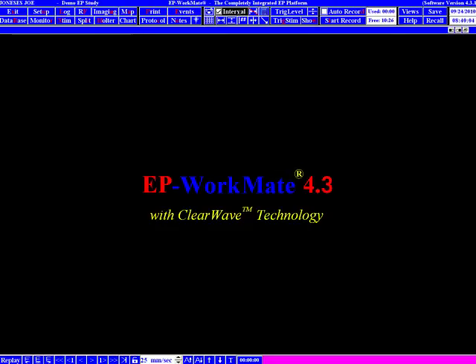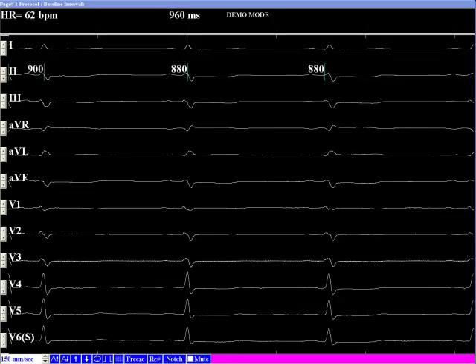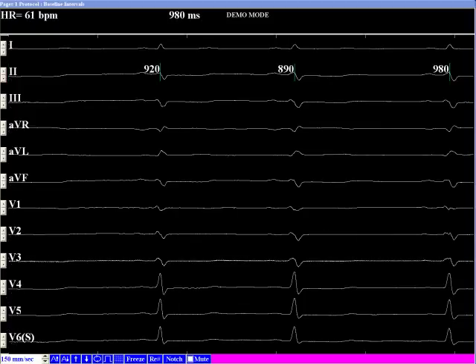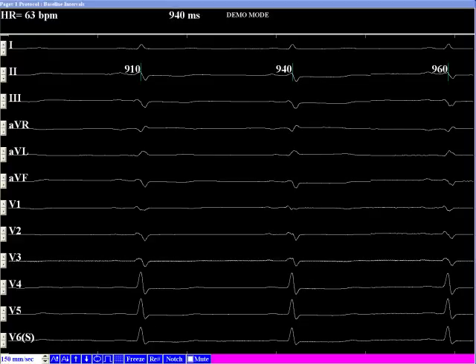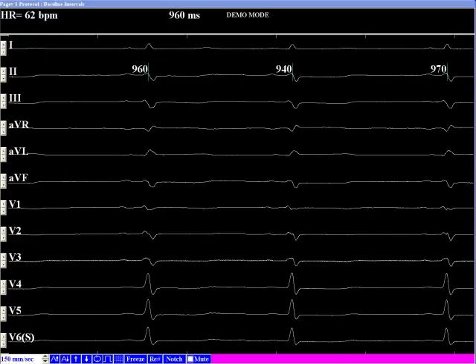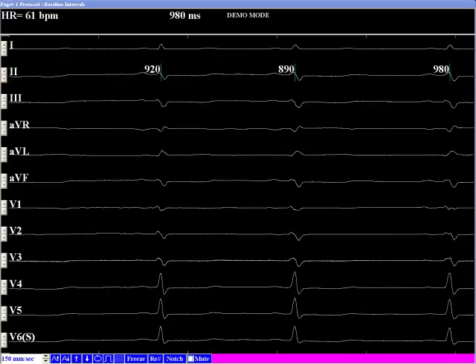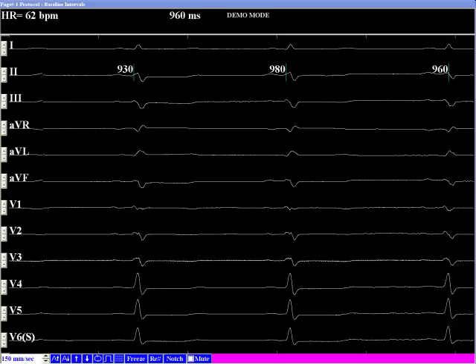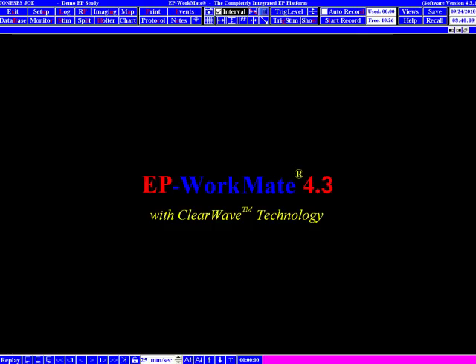Once you click the Start button, the opening menu goes away and your study has been started. You're now looking at the basic EP Workmate Recording System Review and Live Screens. Each screen has its own screen-specific controls at the bottom. The Review screen has controls to help you scroll through information and review and manipulate data recorded during the case. The Live screen has buttons that will help you manipulate your data, change your sweep speed, gains, and other settings.